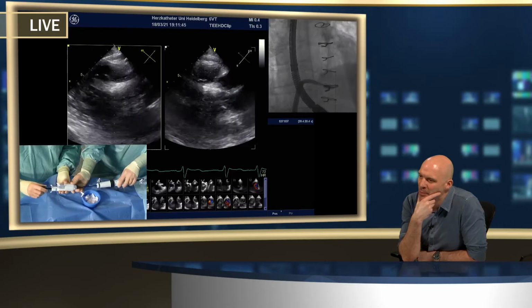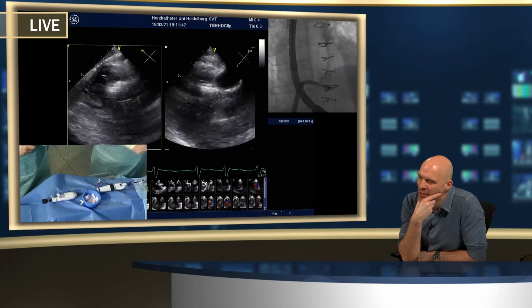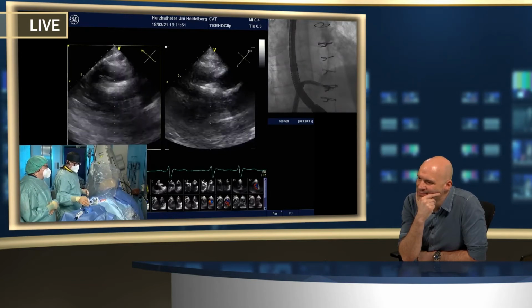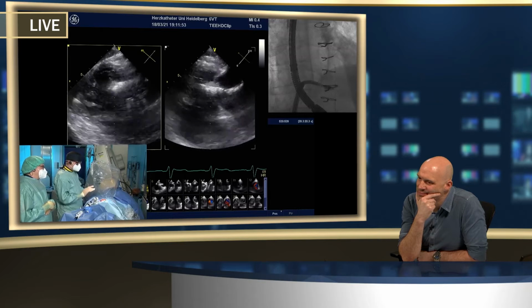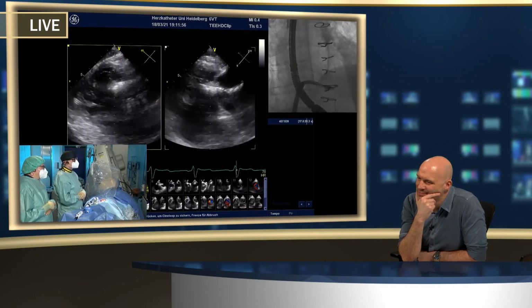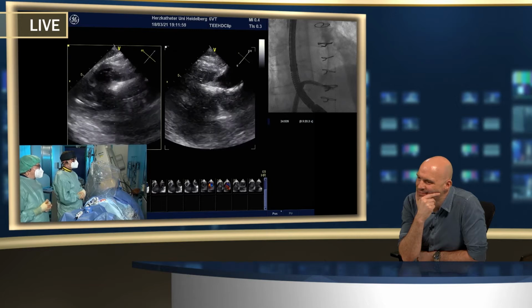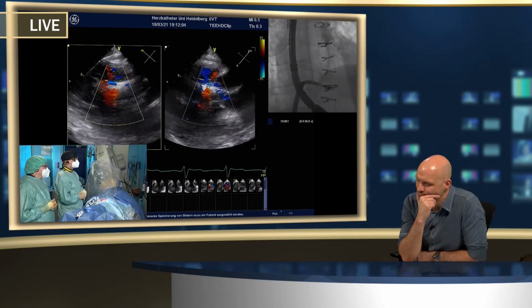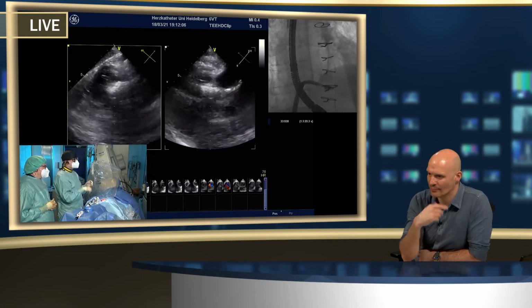There's another question, a practical question from the audience. Do you need to be an experienced PASCAL user in the mitral space to embark in the tricuspid space? So my personal opinion is, I think it's helpful to have some experience with mitral. I think the access to tricuspid is a little bit easier with the device, because you don't need to go transeptal.